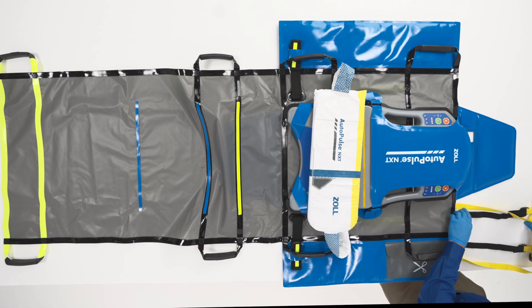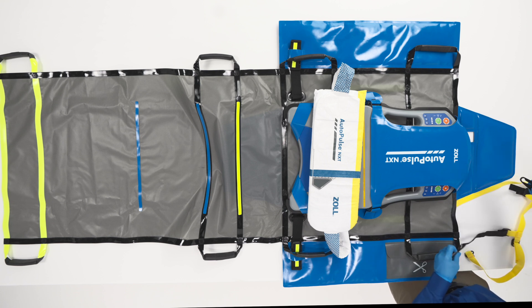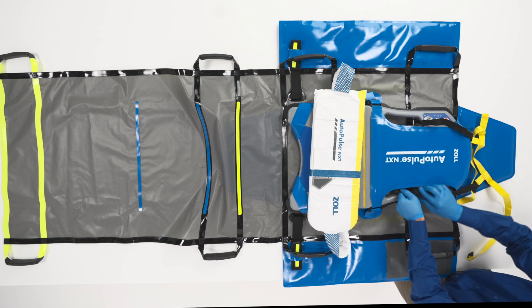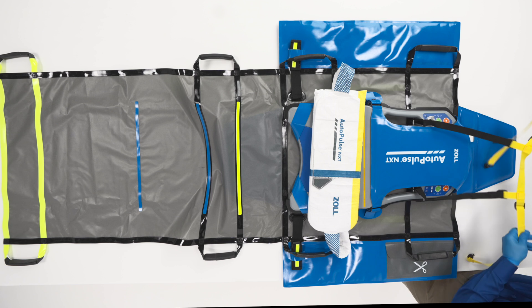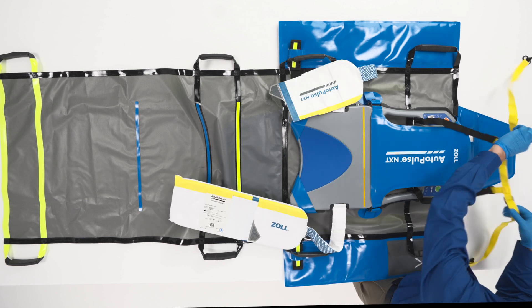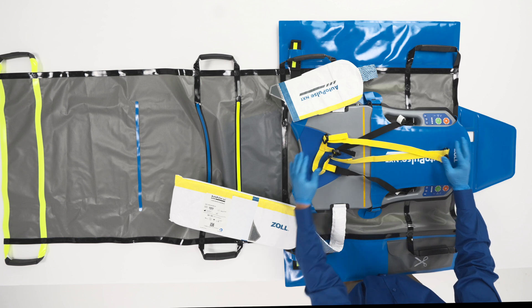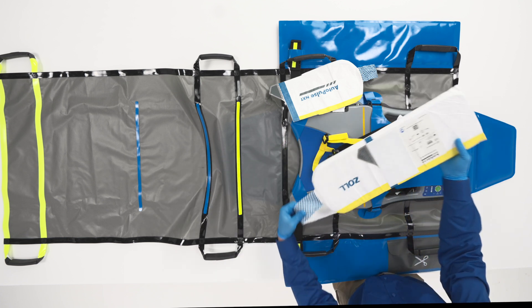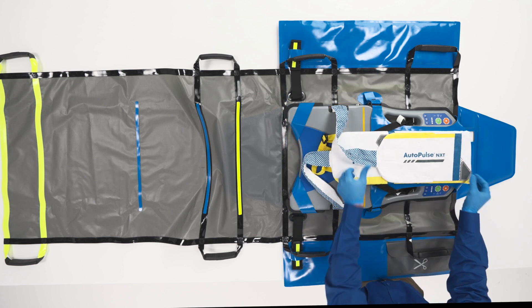The shoulder restraint attaches to the platform to help maintain patient alignment during therapy. To secure the shoulder restraint, attach the black straps to the metal attachment points near the patient's head. Lay the yellow straps across the top of the platform, on top of and parallel with the platform. Place the longer section of the band on top of and parallel with the platform, then place the shorter section on top of the longer one.